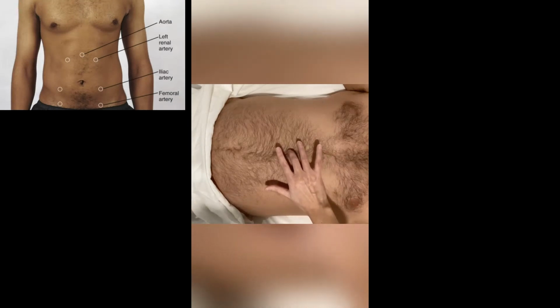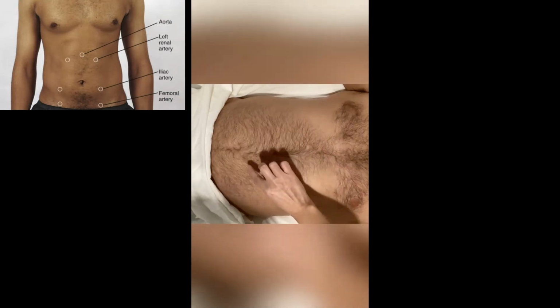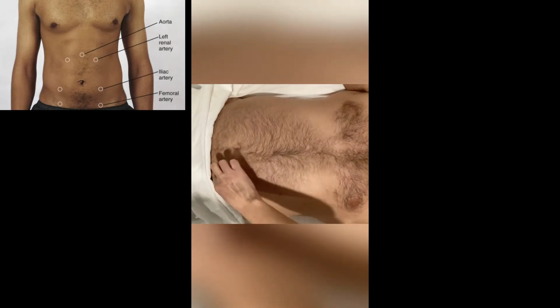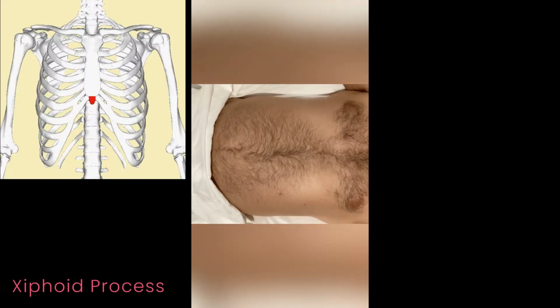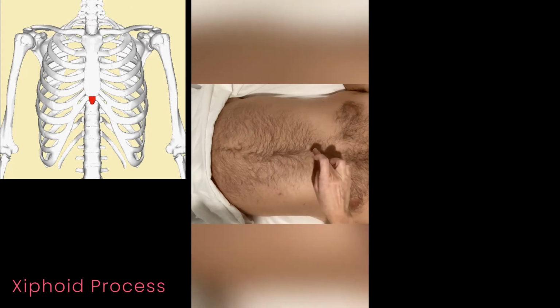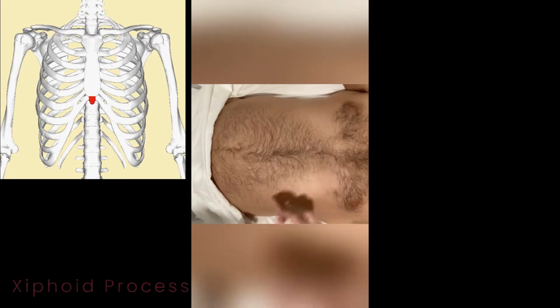Now we're going to listen to vascular sounds, and we're going to use the bell of the stethoscope. We're going to listen to the aortic artery, renal arteries, and iliac arteries. And if you need to, you can listen to the femoral arteries also. The aortic artery is a little bit below the xiphoid process.